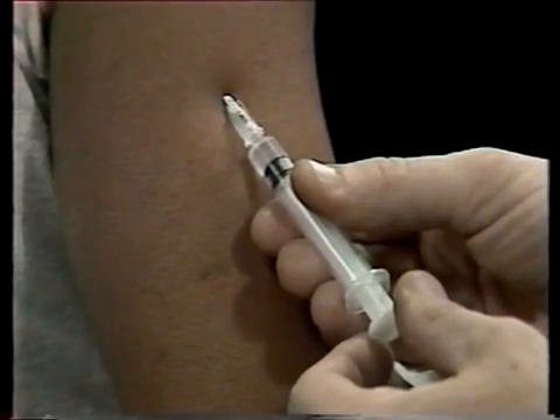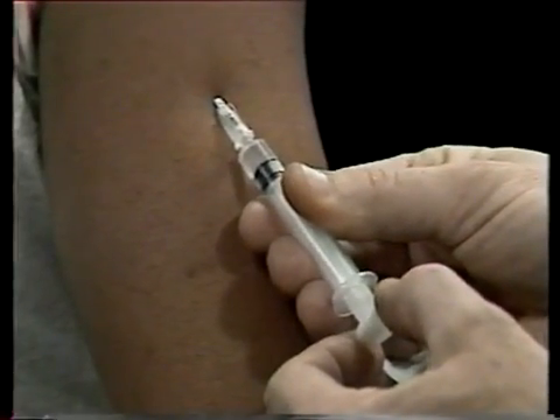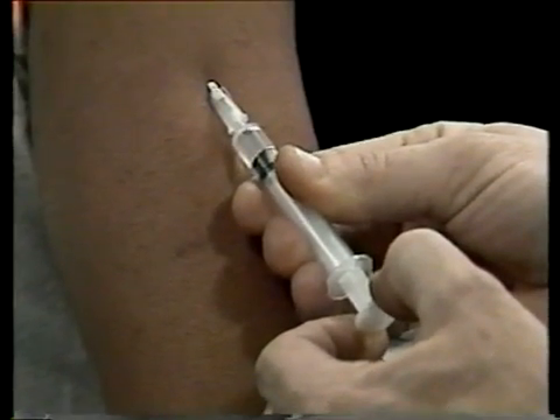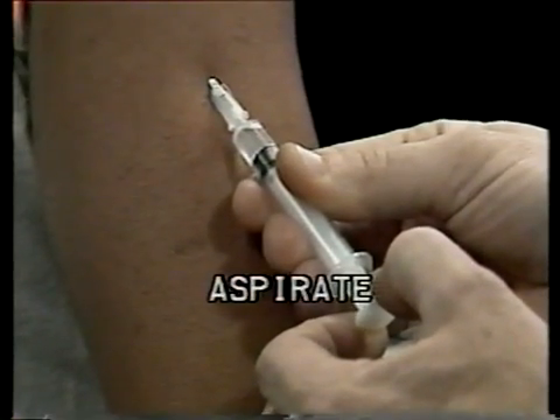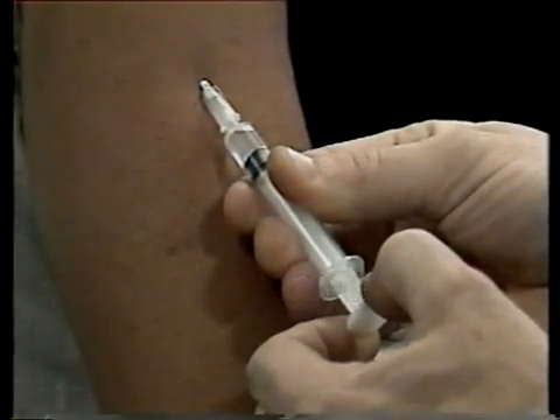Therefore you need to check yourself. Draw the plunger back a bit, or aspirate. If you have hit a blood vessel, some blood will appear in the syringe. If blood appears in the syringe, withdraw the needle and start again.